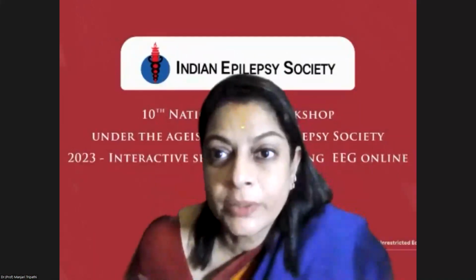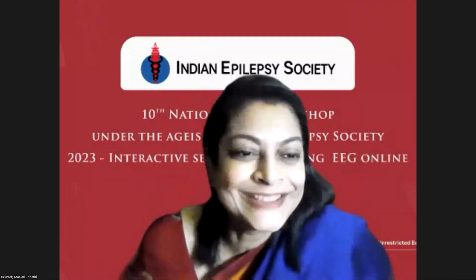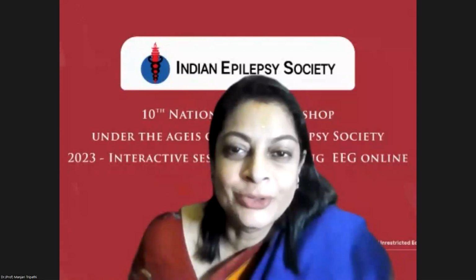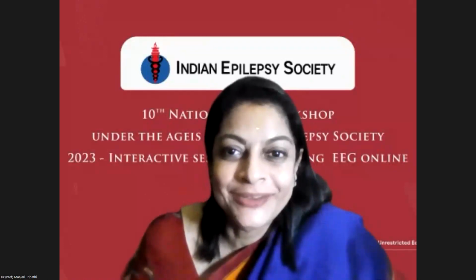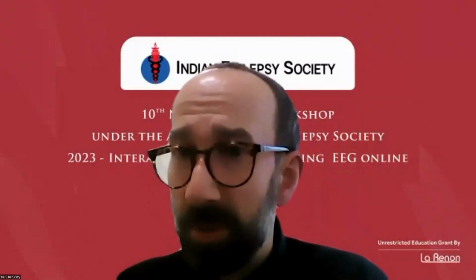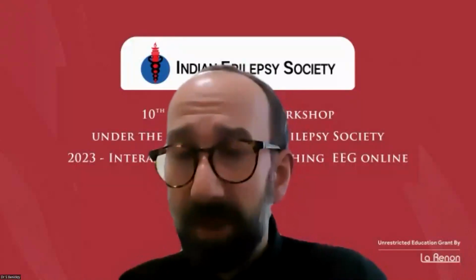The question by Mayuri. Does PEDs, which is periodic discharges, come in NCSE? So basically, I think you should be talking about the interictal-ictal continuum. She's got a query there on that. Right, and the short answer is yes. So you can have periodic discharges at so high frequency that they immediately fulfill the criteria. And I showed you several examples. For example, I think the last case was a GPD with a 3 Hertz frequency. Well, it immediately fulfills the criteria.